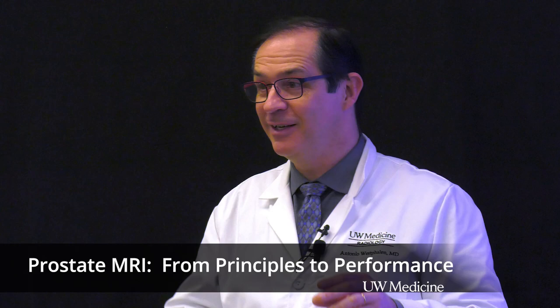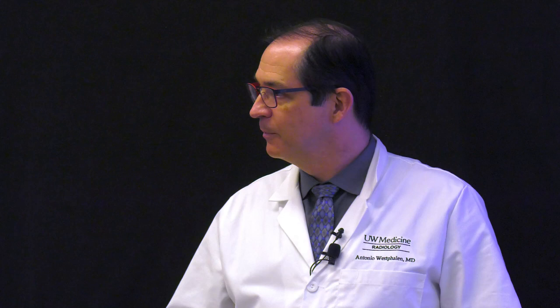Yeah. That's one of the things I try to highlight with the voxels, with the mixed component. I put two things, water and dirt, but really you have water, you have dirt, the dirt that's wet with the water, you have pebbles, you maybe have fish bones, and there are so many other things there. With the current technology, I think it's impossible to get that granular. Not yet.